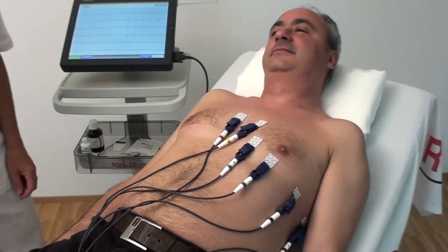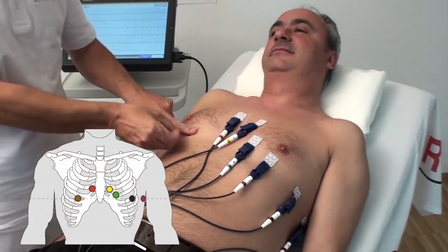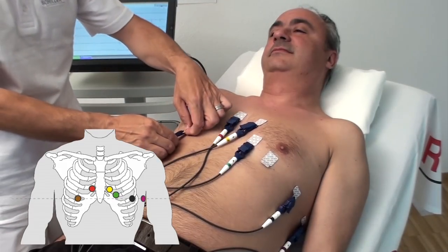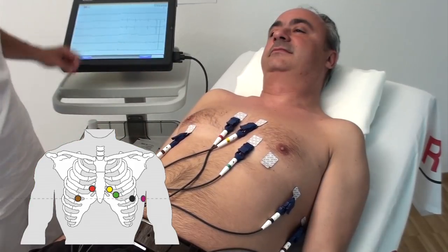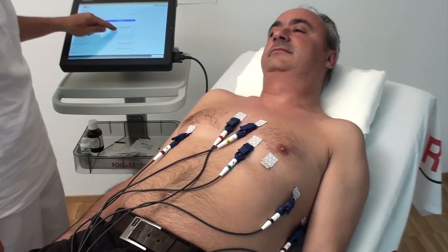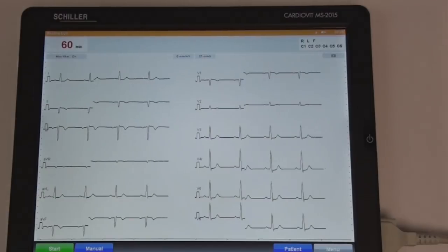Right precordial lead C4R is recommended for patients suffering from a myocardial infarction with inferior ST elevation. The electrode C4, brown, needs to be repositioned in the inverted C4 position. Check the ECG signal on the screen and ensure that a good signal is displayed.